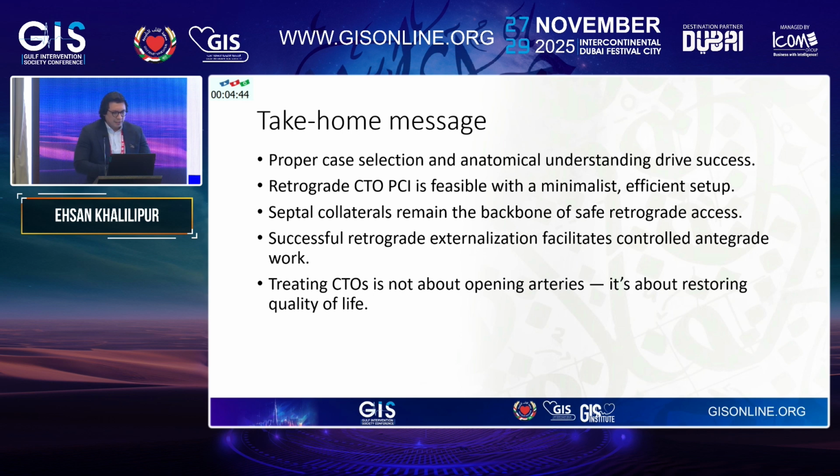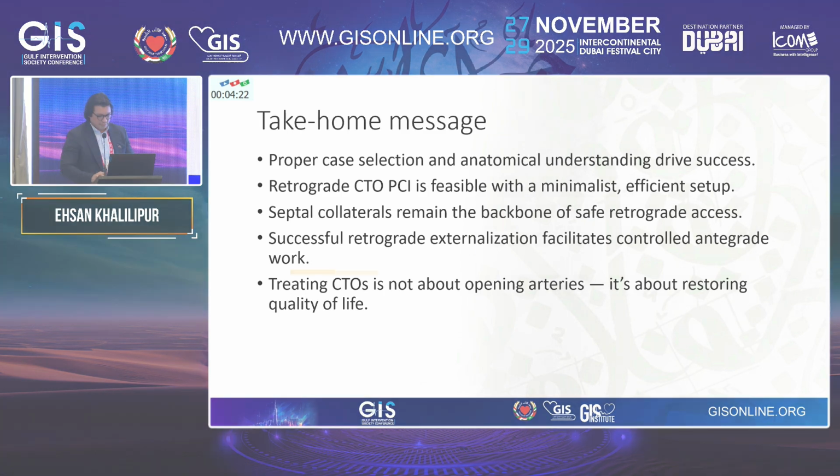Well, proper case selection and anatomical understanding drive success. Retrograde CTO PCI is feasible with a minimalistic, efficient setup. Septal collaterals remain the backbone of safe retrograde access. Successful retrograde externalization facilitates controlled antegrade work, and treating CTO is not about opening arteries, it is about restoring quality of life. Thank you very much.